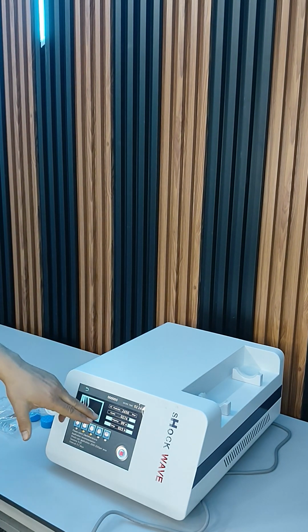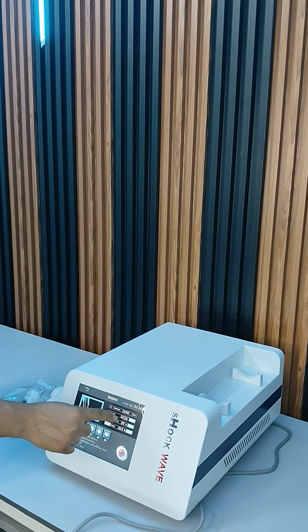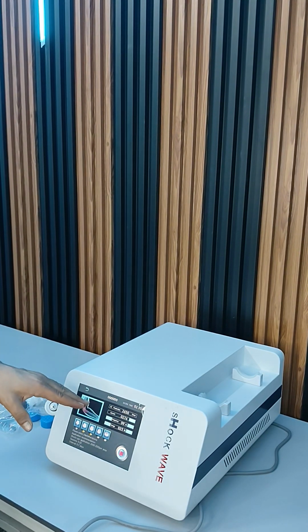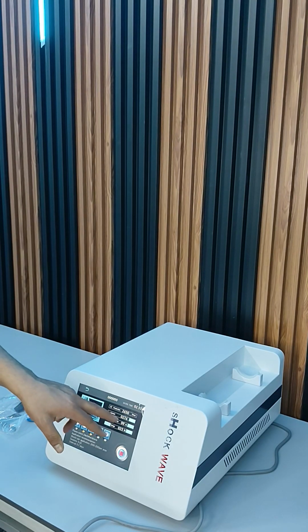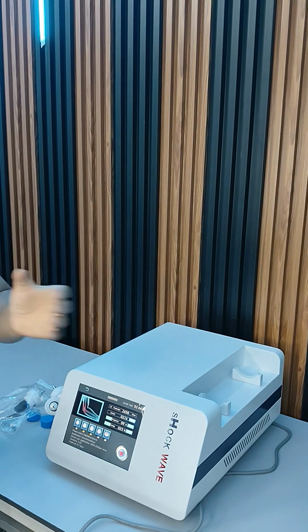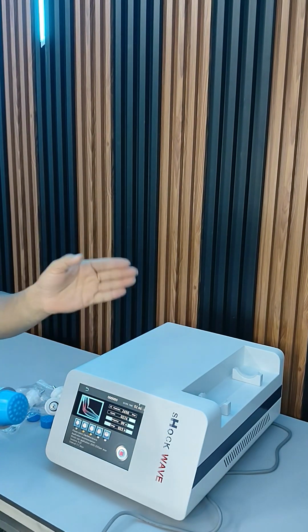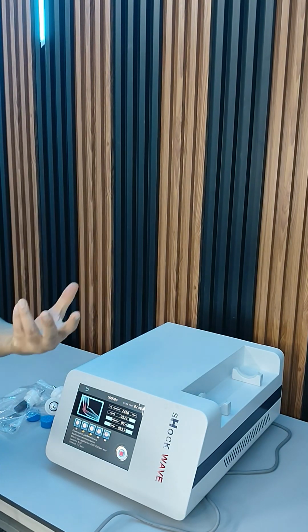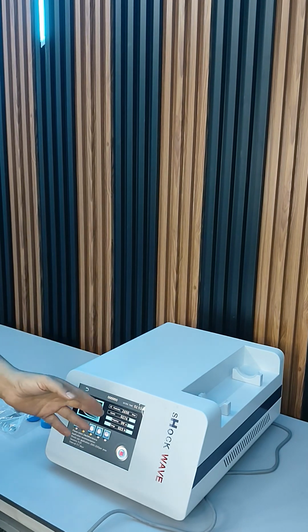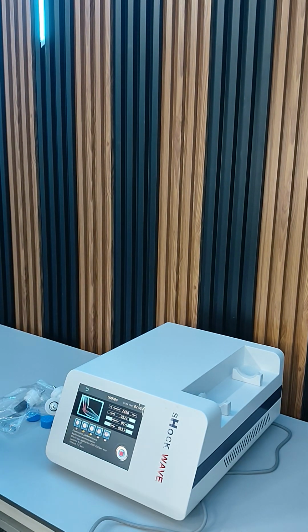Now you can see I have used the same. The shots I am getting are getting counted. So I have selected 2650 shots for the treatment, and currently I have got 276 shots. For frequency 1 Hertz, it will slowly give me the shots like I have shown you, and it will keep on counting. If I increase the frequency to 10, then 10 shots per second, it will keep on counting like this.